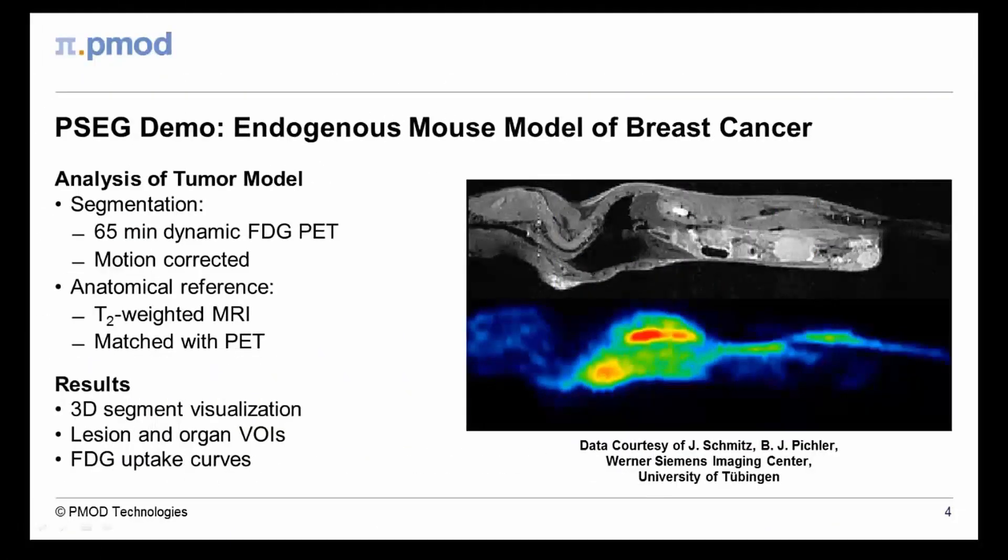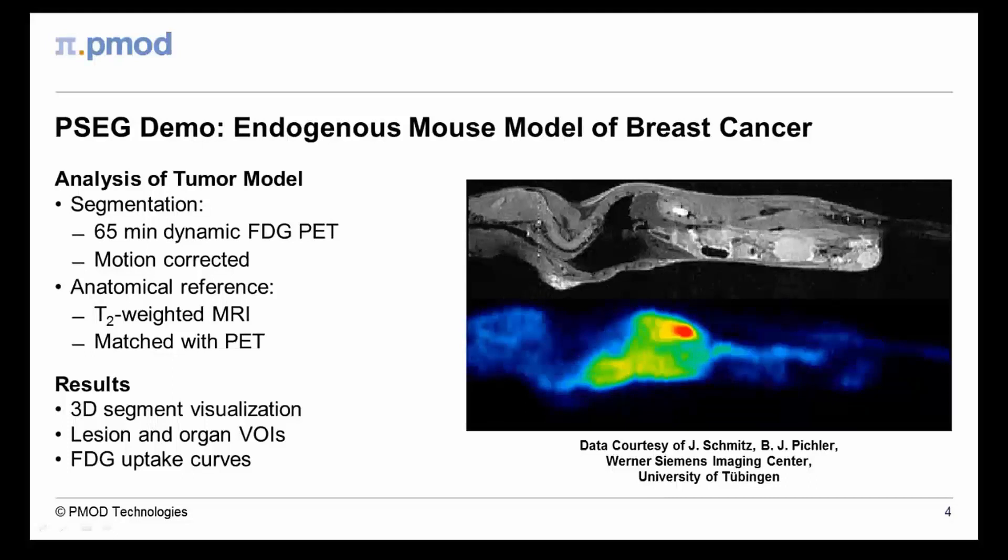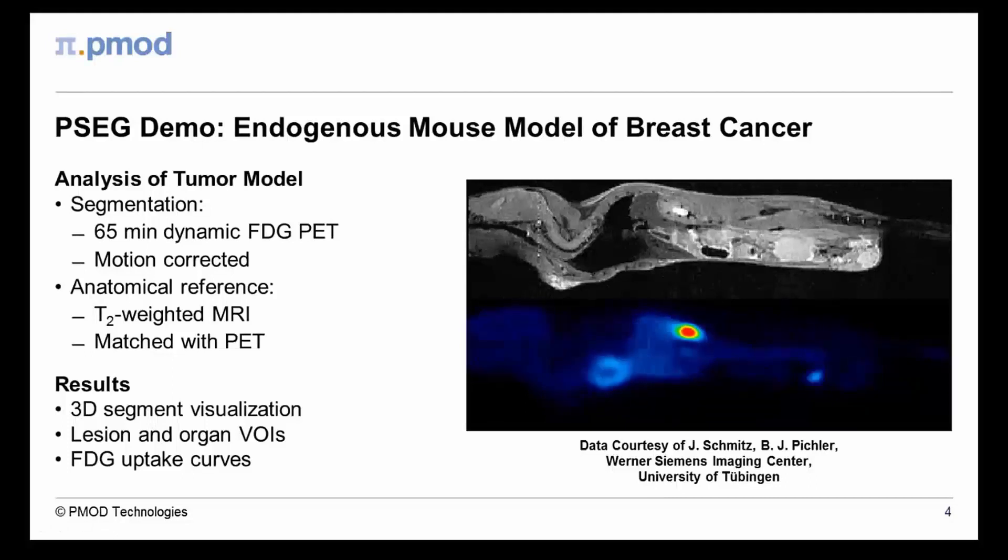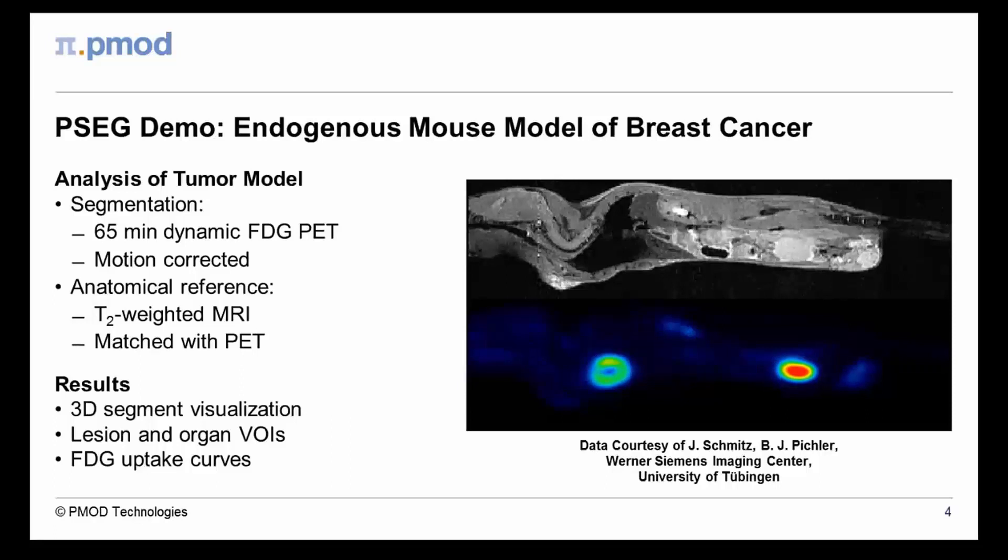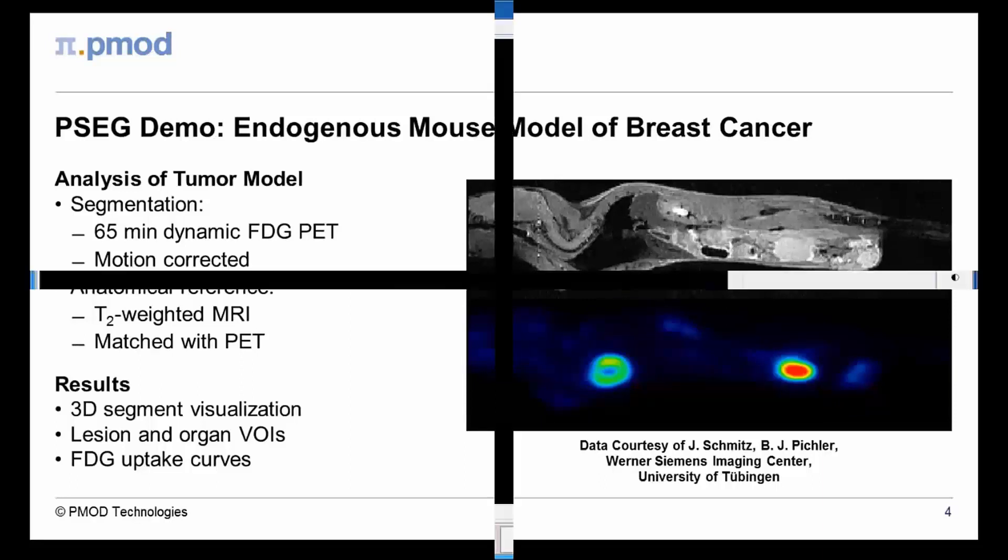The following three-minute demo will give you a brief impression of the PMOD image segmentation tool. It uses dynamic FDG PET data in a mouse model of breast cancer for the segmentation of tumors and organs and a matched MRI image for anatomical reference. The segmentation is visualized in a 3D scene and finally applied to the PET for the calculation of the uptake curves.